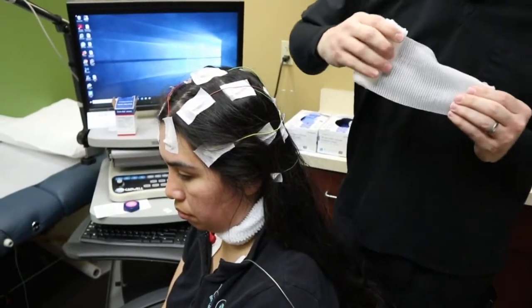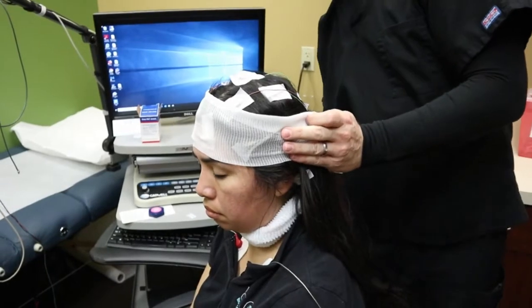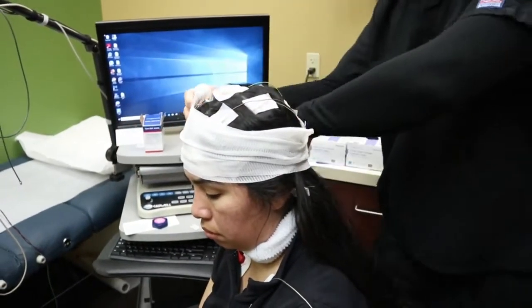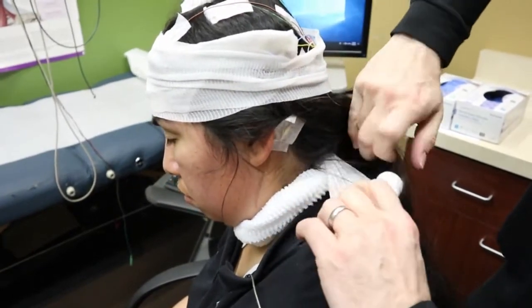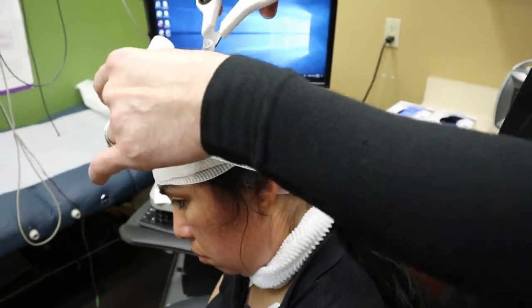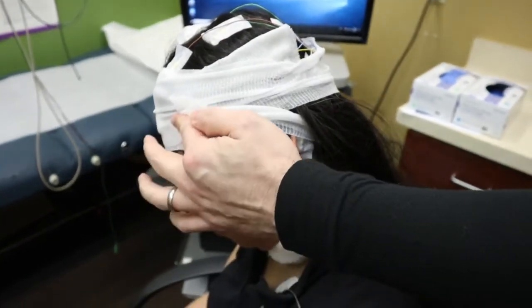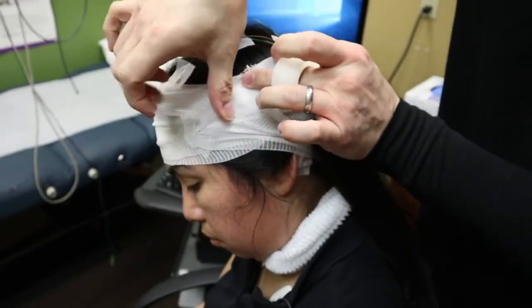Now I'm going to wrap the patient's head in some gauze. I'm going to start above the left ear, come around the forehead — I'm only laying it on top, not pulling it tightly at all — then come around the back nice and low. I'm going to make a second pass. This time when I come around the back, I'm going to come under the patient's hair and catch as much of A1 and A2 as possible in this pass. I'm going to cut it off right there. When I tape it, I'm going to pull the bottom nice and tight — that's to give A1 and A2 a little extra support — and then put a second piece of tape just to hold the rest of it in place.